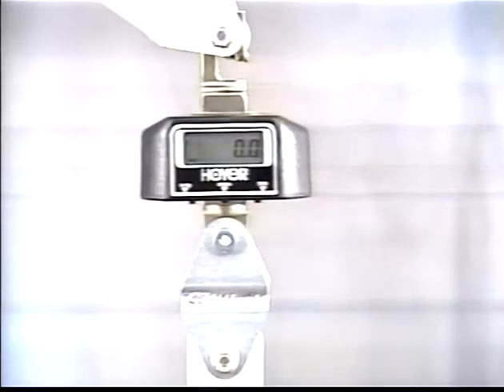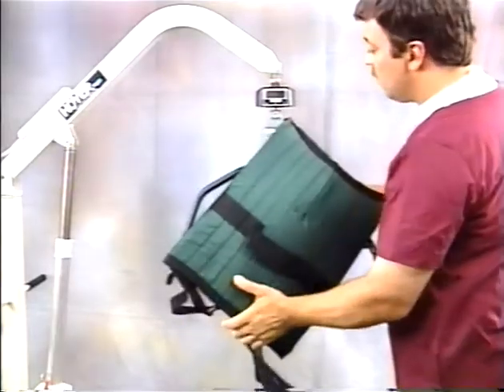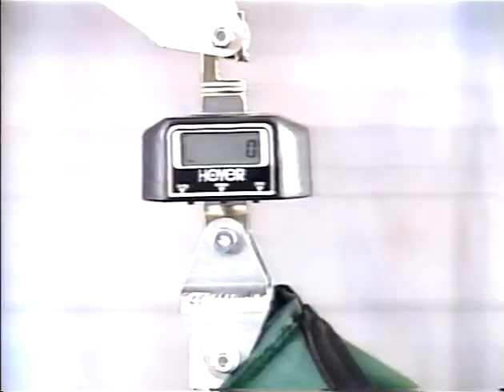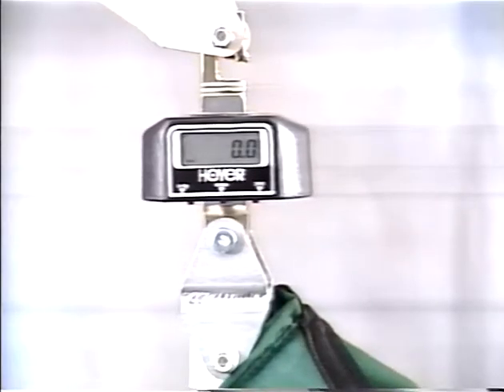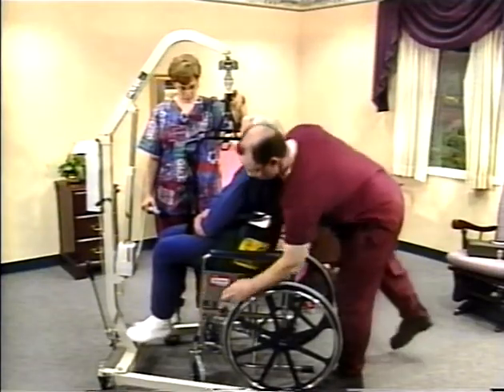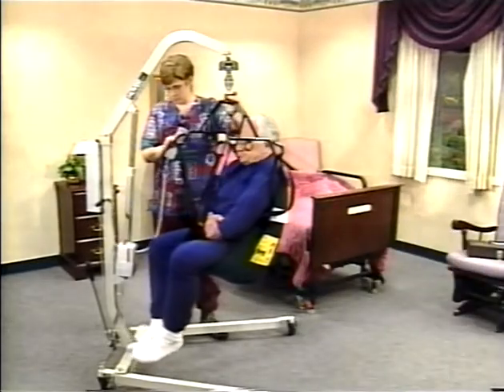Your Hoyer lifter may have an optional scale mounted between the end of the boom and suspension cradle. All it takes to operate is a single button. Drape the sling over the cradle. Press the 0 button to zero the scale. This compensates for the weight of the sling and assures an accurate reading. Now, apply the sling and lift as usual. Of course, you always use sound transfer techniques.